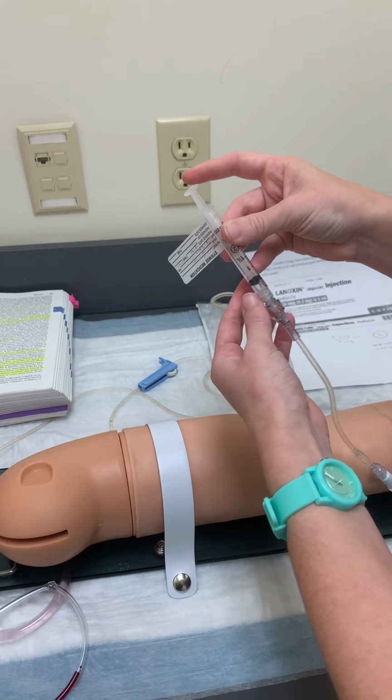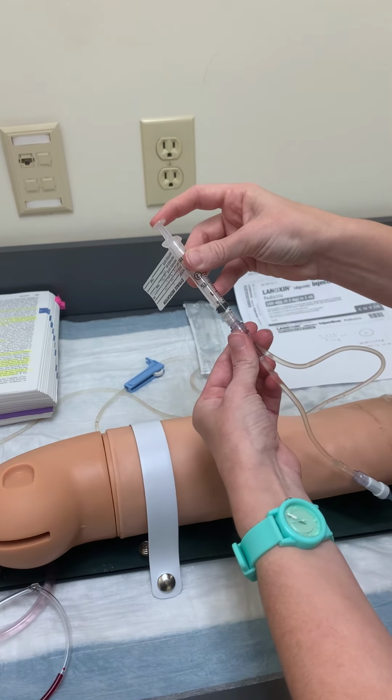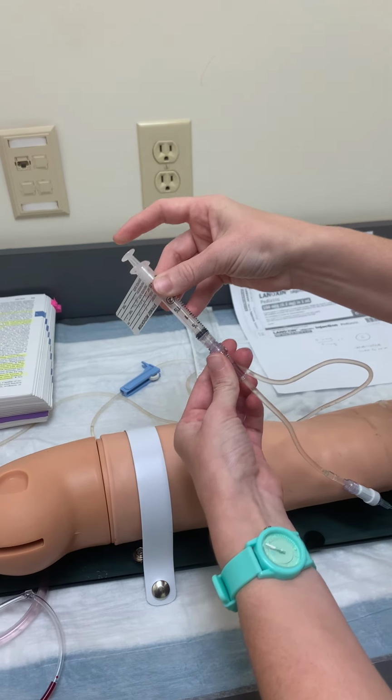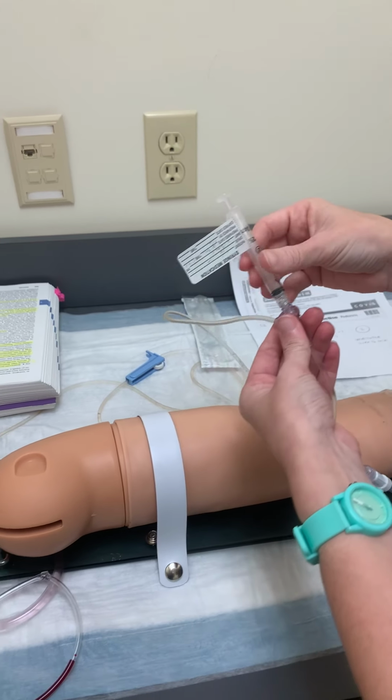Alright, my last interval, I will clamp down and push my last 0.4 remaining of medication. And open back up and let that flush through for a minute.